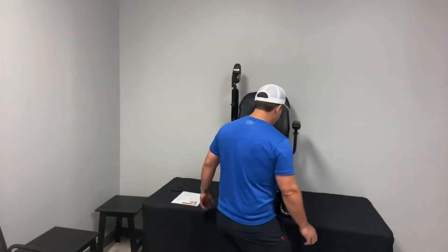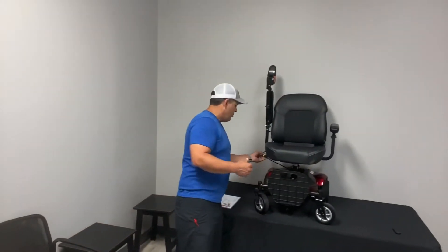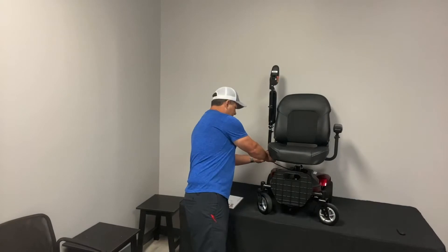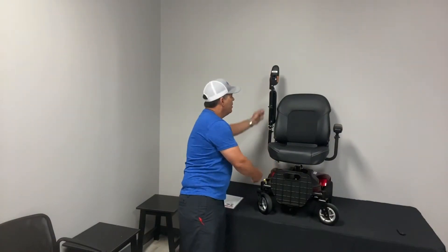What I typically recommend when you're disassembling something is that the first thing you do is disconnect the joystick.